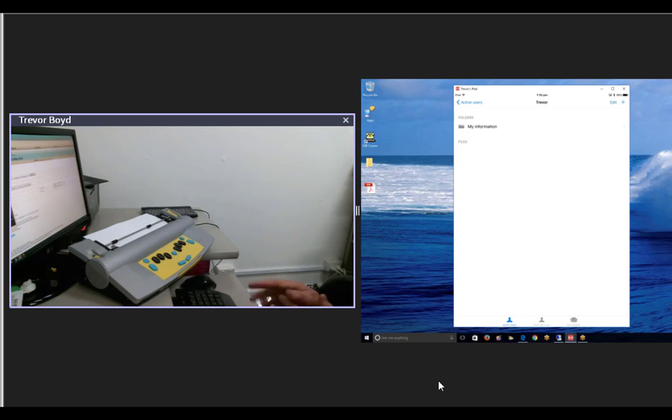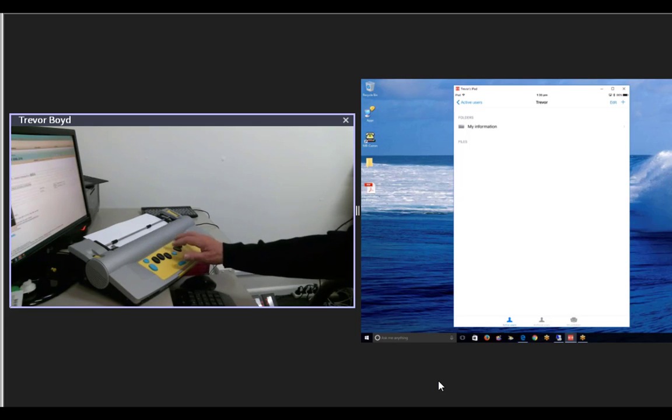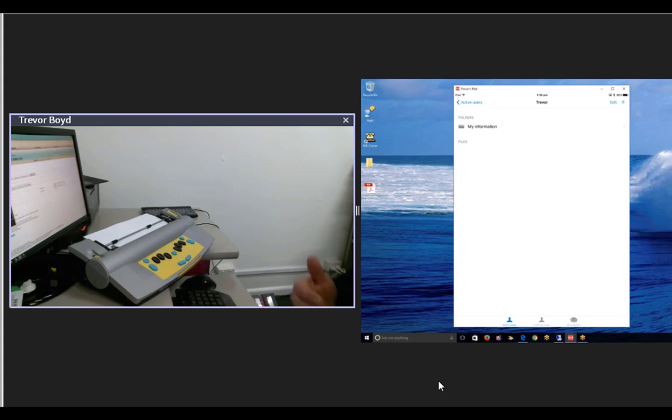So there's lots of really useful features. I can also gather files from the Mountbatten. I can have a look at what the student's been doing. This is why, when I mentioned you can save files, like simply command BEGIN file name, I can create files in the Mountbatten. So anything that's created in the Mountbatten, I can then have a look at with one or a couple of these sorts of programs.